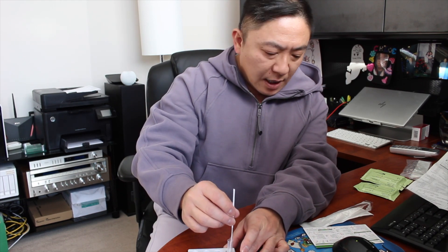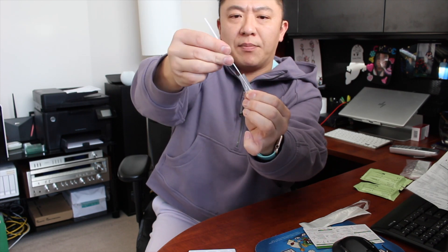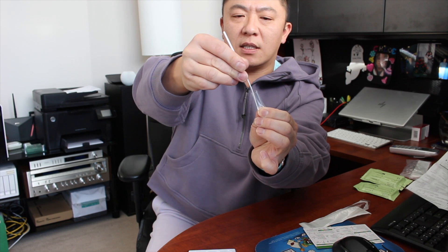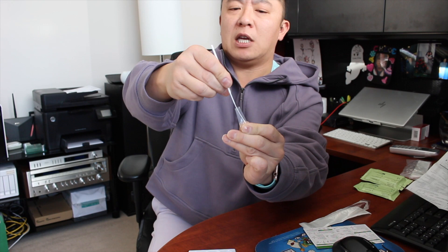The next step is to insert the swab into the reagent solution and swirl it to mix the secretions into the solution. I'm spinning that around and giving it a good mixing. I'm squeezing the soft test tube to get the solution all around the swab tip, making sure the solution is fully saturated with the material from the nasal swab. Applying pressure to the swab tip to maximize extraction.